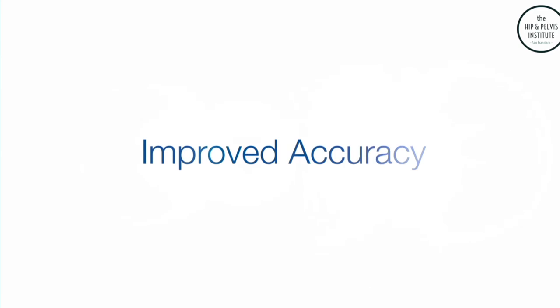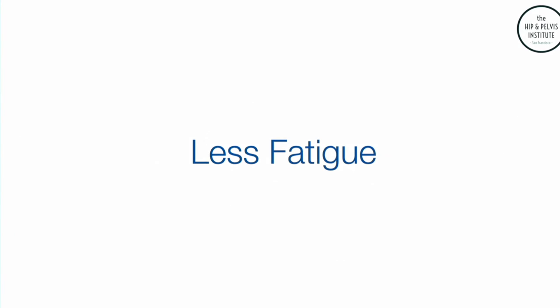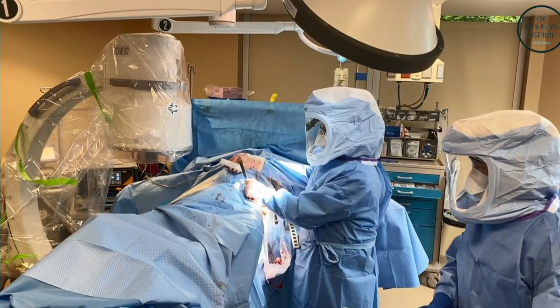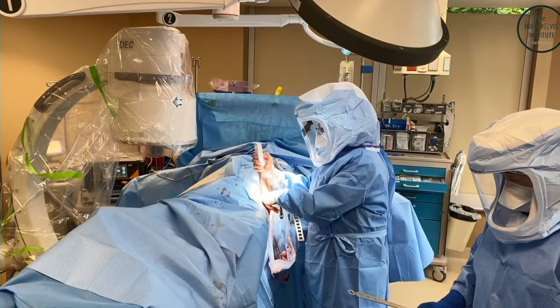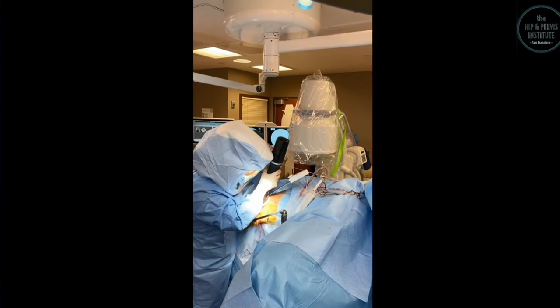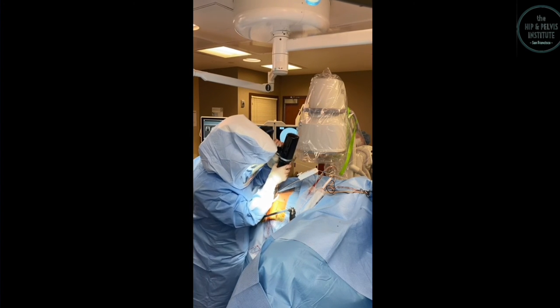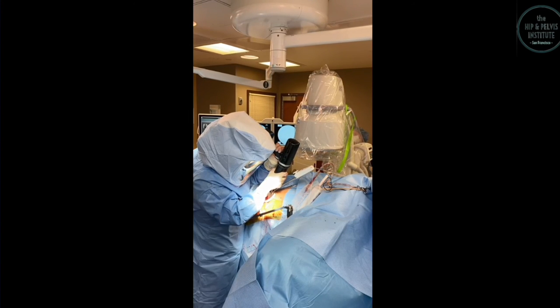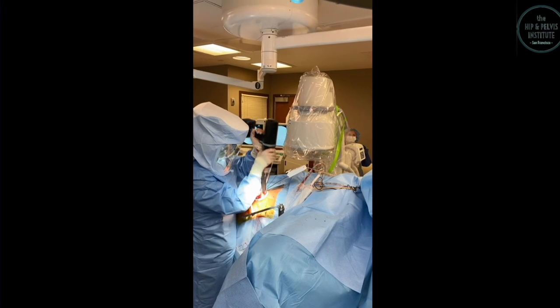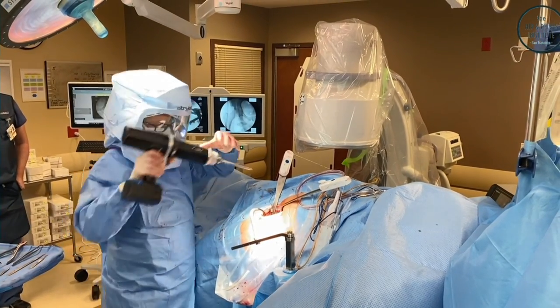I'm checking x-ray, I leave the retractors in place. And using some of the facilitating technologies, we're getting really good accuracy with less fatigue. At the end of the day, I'm using some of these facilitating technologies which take the load off my shoulder. Typically, we're able to reduce the number of broaches we're using down to two or three, going to the final implant.